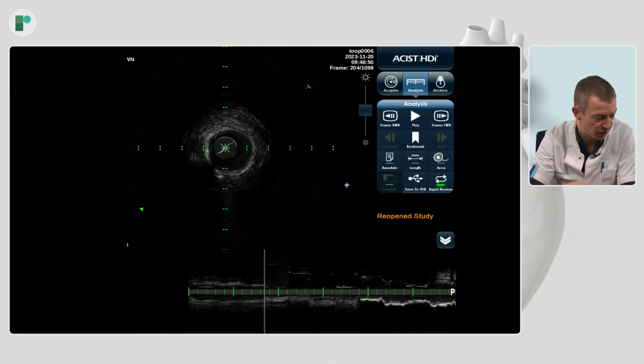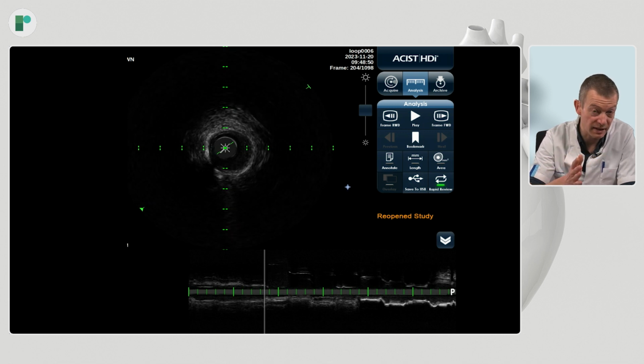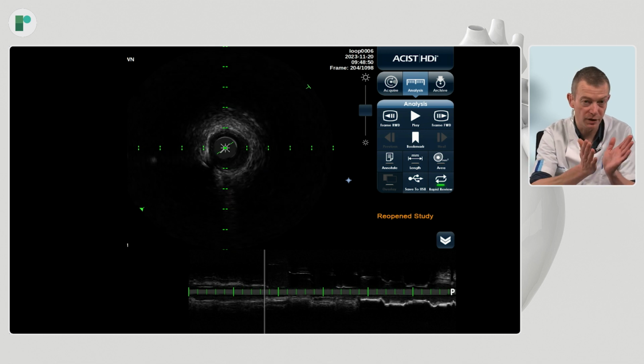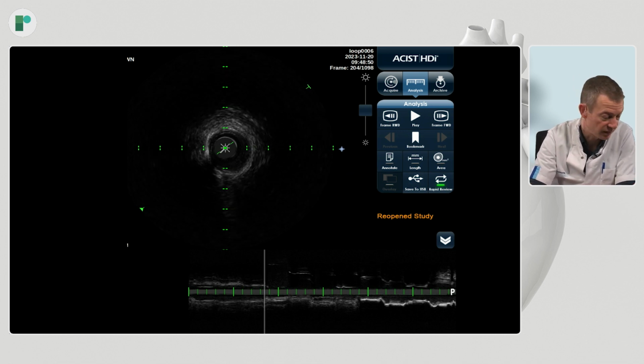So for this small side branch, not a big deal, but if you would have had a bigger bifurcation, crossing a distal strut and then stenting in case needed, would have likely yielded a better result and a nicer carina as compared to this bifurcation, in which we ended with struts that were completely behind each other in the proximal part of the carina.